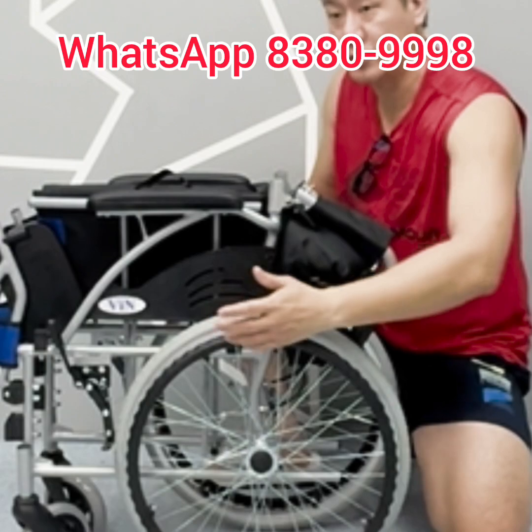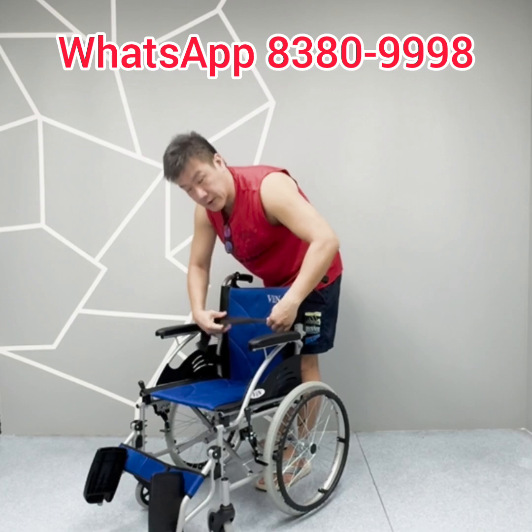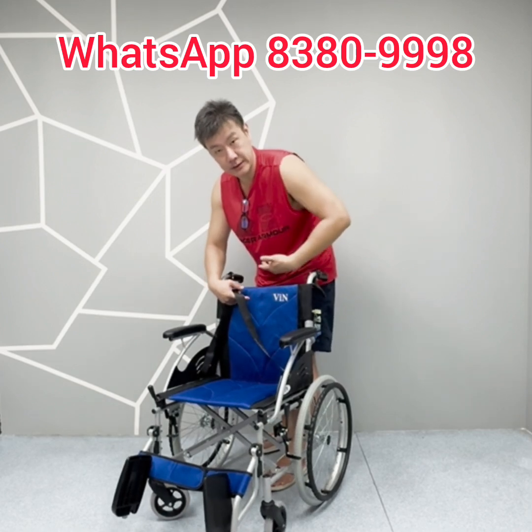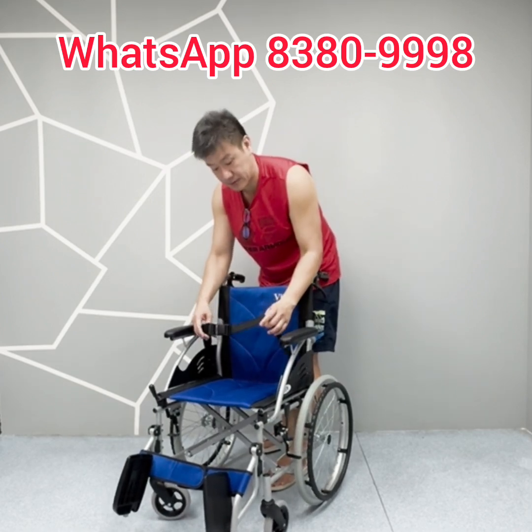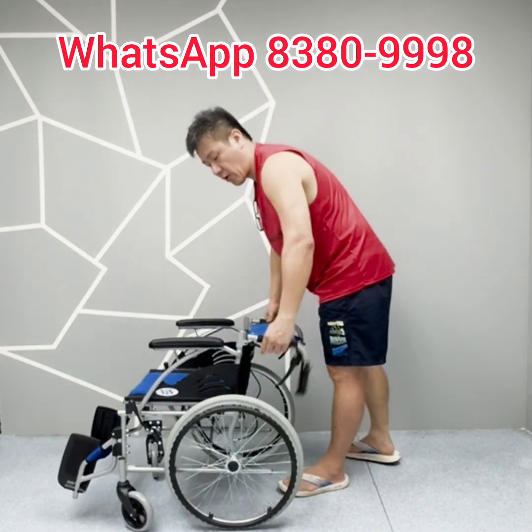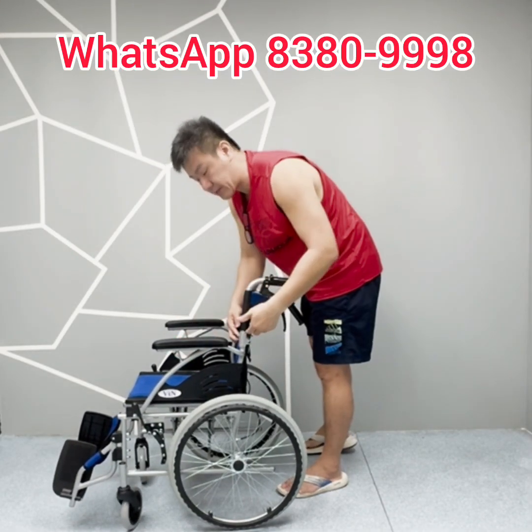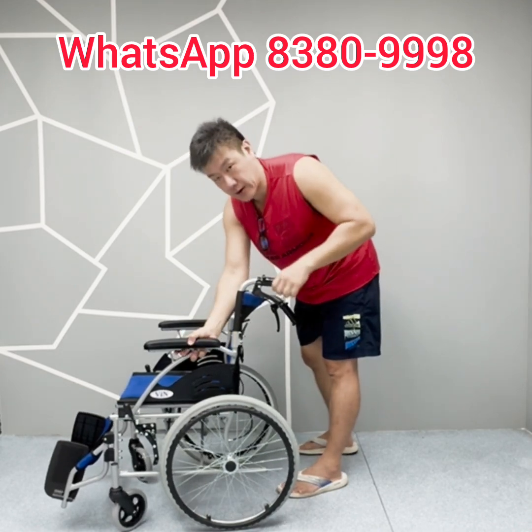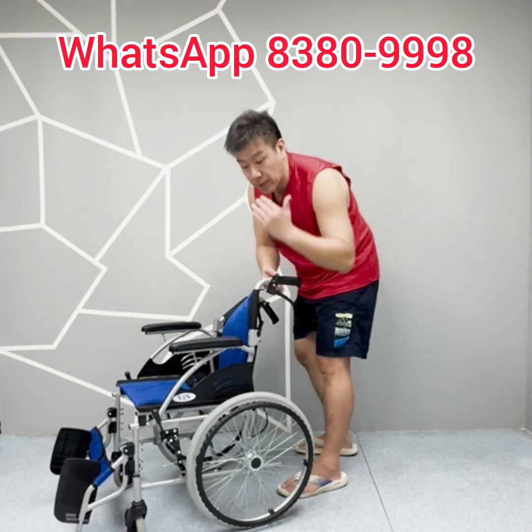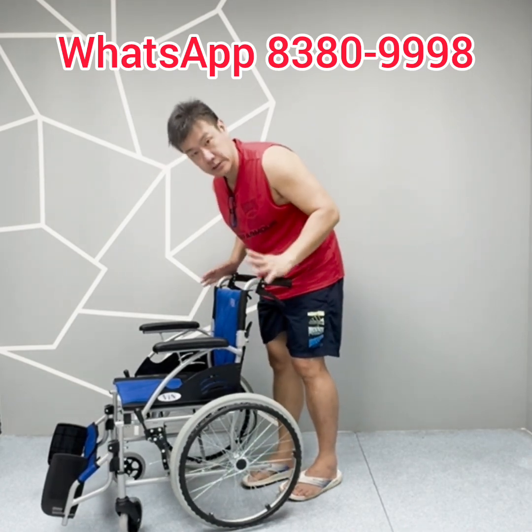It comes with a sideboard so that when the user is self-propelling, their clothes will not touch the tyres for hygiene. It also comes with a silky and robust safety belt — the silky material prevents abrasion on the user's stomach during long sitting. The armrests use 4mm thick aluminium for increased thickness. A rubber seal ensures the armrests are very robust and durable. Screw caps are covered with a round protection cap so the assistant or user will not accidentally scratch their fingers while using or pushing the wheelchair.